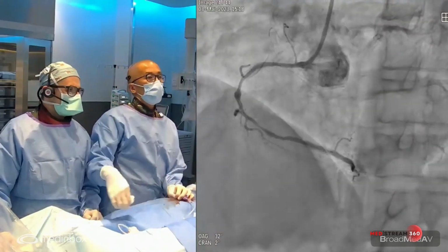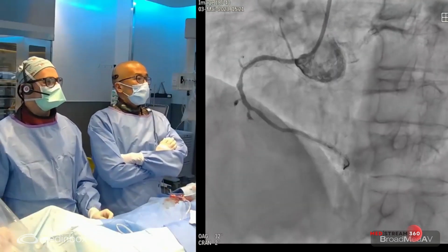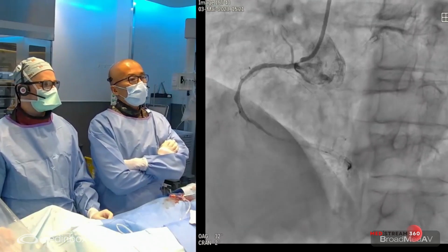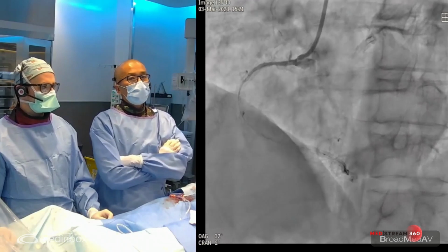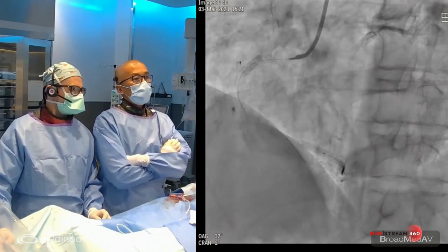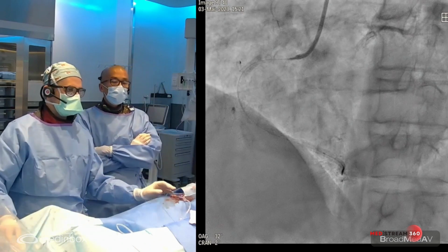And with that, we'll proceed with the Shockwave balloon. Yep. So if I see that in the coming minutes we don't have access to the Shockwave, what we could attempt to do is get an OPN 3.0. So try to crack, and then once we use the OPN, we could move towards another OCT assessment. Because at the end of the day, what we really want is to be able to cause fractures that ideally are visible.